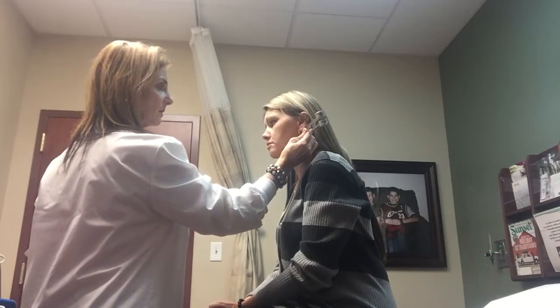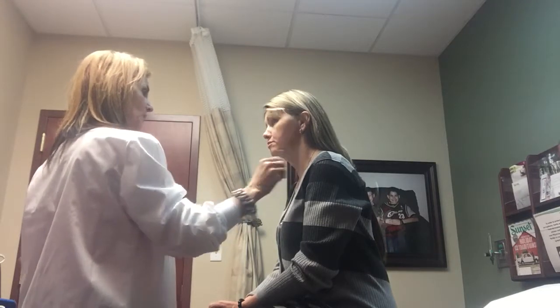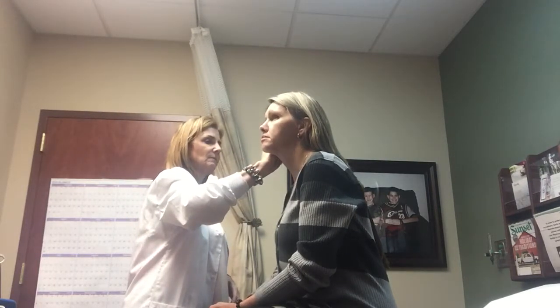Both. Good. Now we're going to do the same thing again, but I'm going to place it back here behind your ear on the mastoid bone. And I want you to tell me when you stop hearing the sound. Now. And tell me when you stop hearing it. Now. Good. And do the same thing again. Now. And again. Now. Perfect. And what that does is it checks the conductivity of your hearing through the bone and also through the air, and the conductivity through the air, which goes through the ear canal, should be twice as long as what it is in the bone conduction, and yours was, so that was normal.